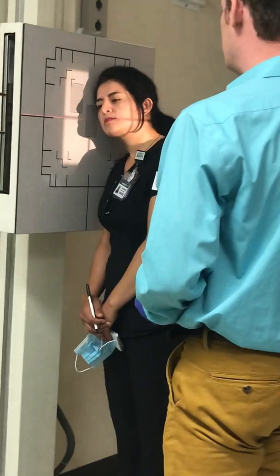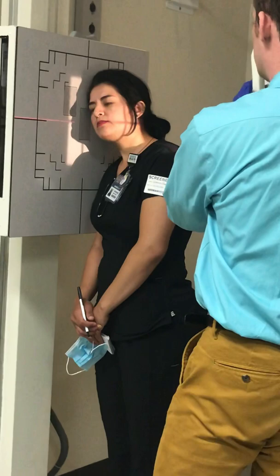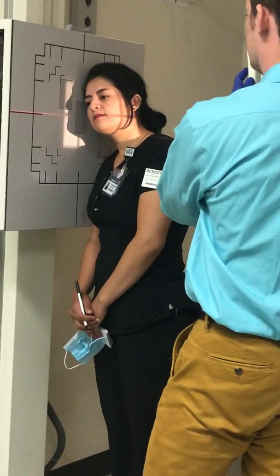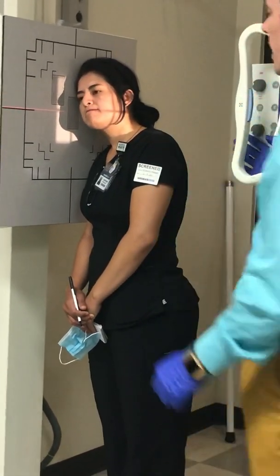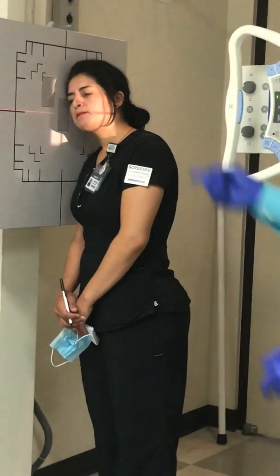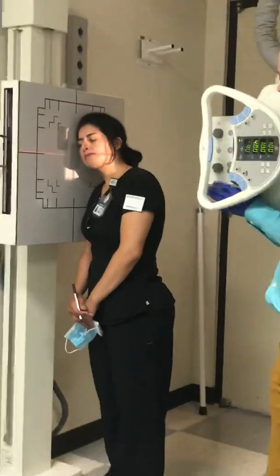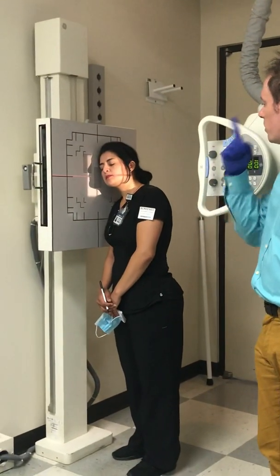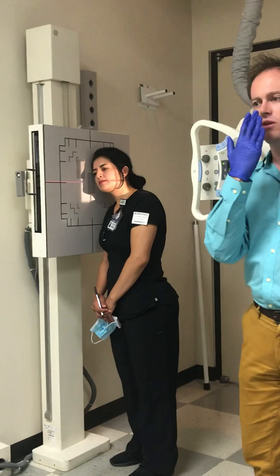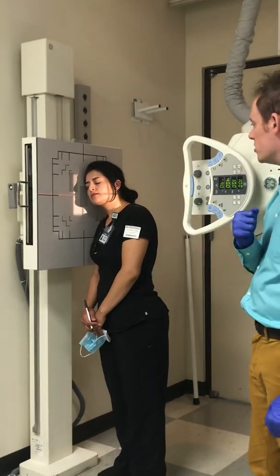This is definitely a great way if you do a competency — much easier in my opinion. Bring your collimation down. Make sure you're still clearing those TMJs. Be careful with your collimation, because the mentum, as you know, is part of our mandible. Don't go so crazy with your collimation that you chop off the tip of that mandible. A lot of times the nose is a good reference point, but some people with very short noses, it may be shorter than the mentum. Be careful — use your critical thinking skills and your best judgment.